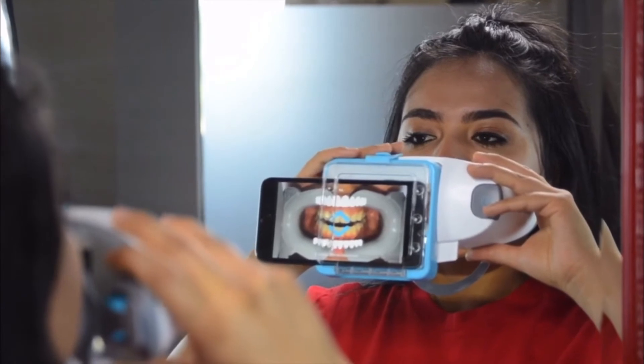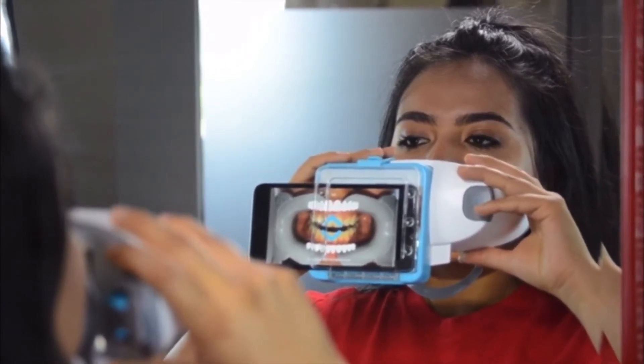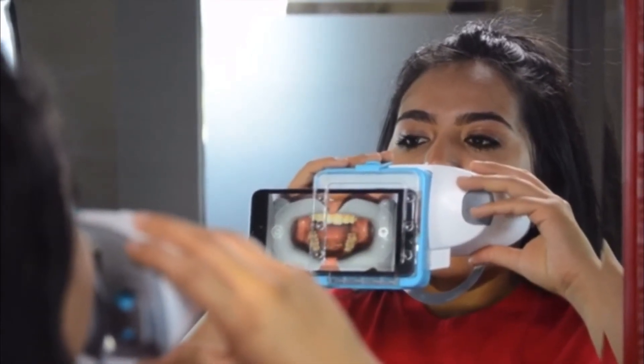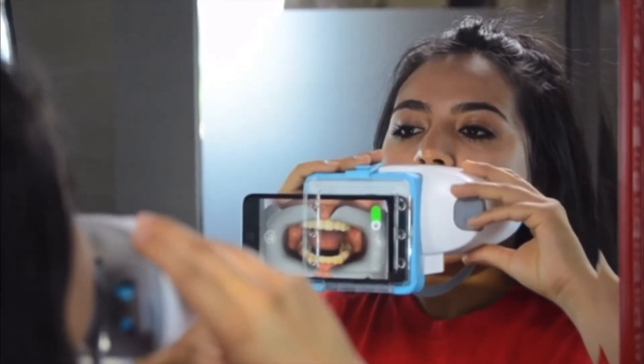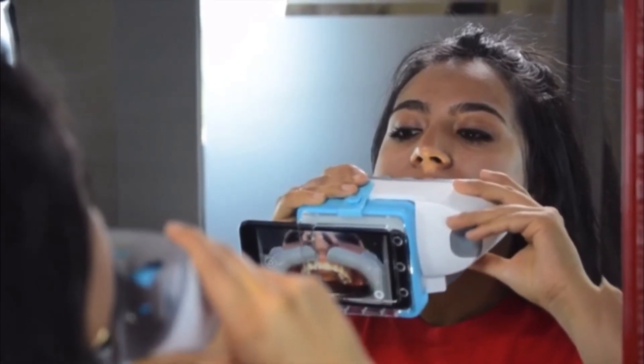For this next step, you'll have to open wide and scan up and down. Double tap to continue. Open your mouth as wide as you can. Tilt the scan box up. Now tilt the scan box down. Back to the front.